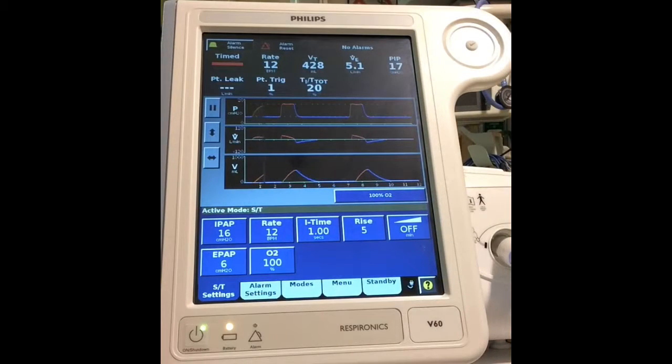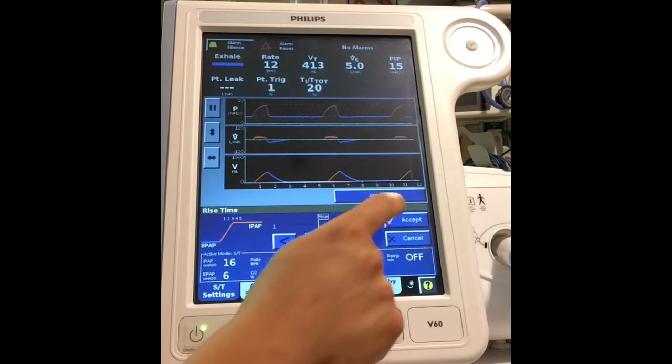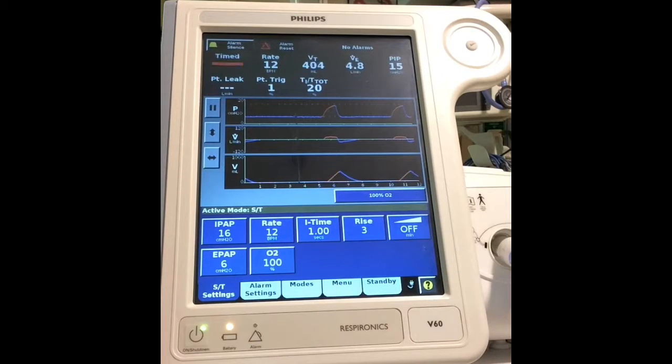So we hit that. Now it delivers a slow breath, and that patient's back to feeling like, "I cannot breathe again." That's way too slow of a breath. Nine times out of 10, I end up right back on a 3. I hit accept, and now my patient feels comfortable. It's allowing them to have a little bit more control over the situation. This is a scary time for them. They're on a machine that's helping them breathe.